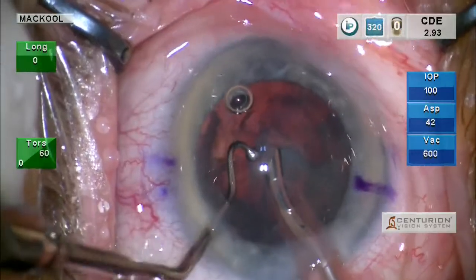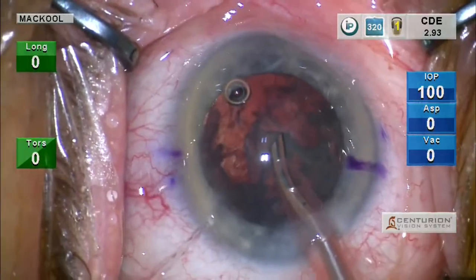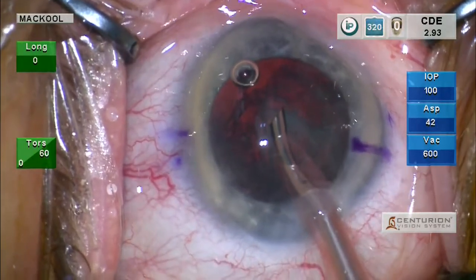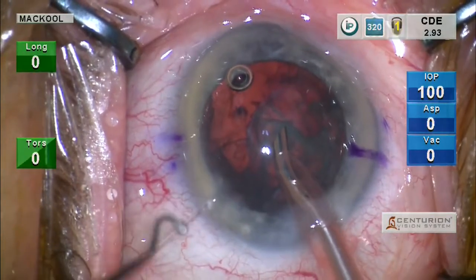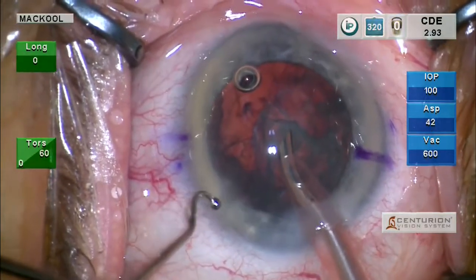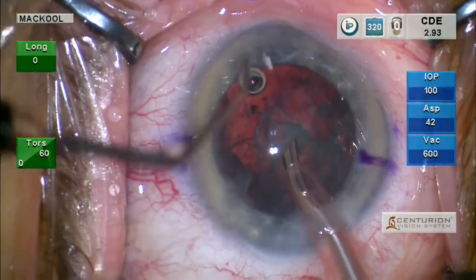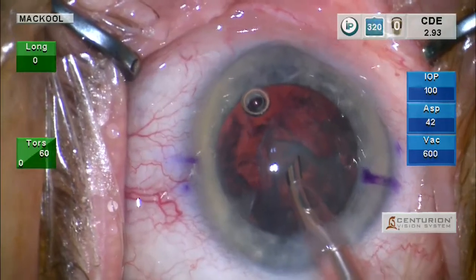And even now, right in the middle of this procedure, I'm going to put some more viscoat right in the center. We'll just pause for a second here and get some more. Everything's fine, no flow, nothing going in and out of the eye.